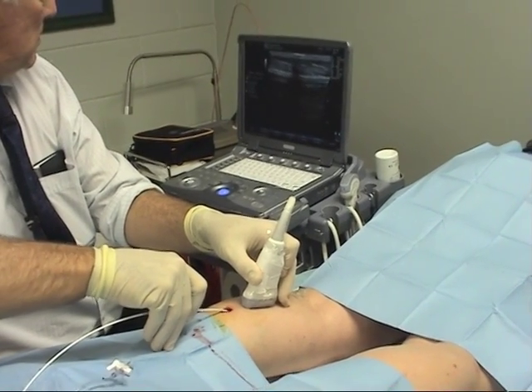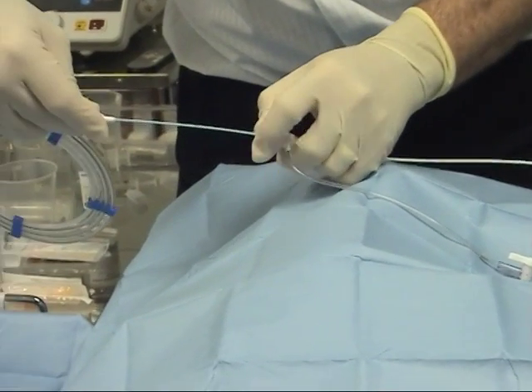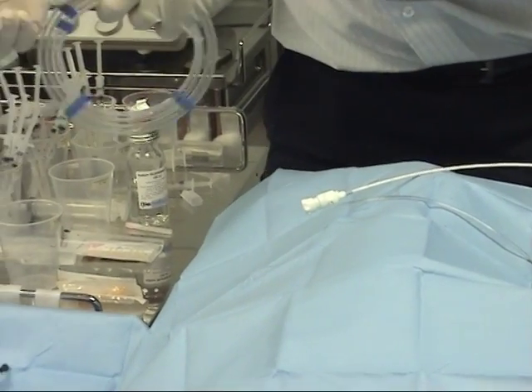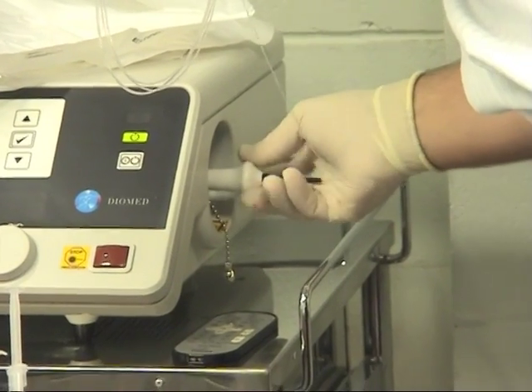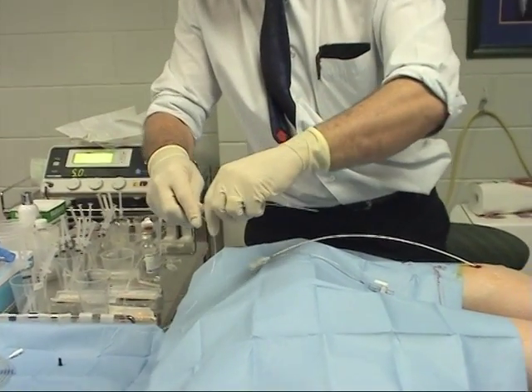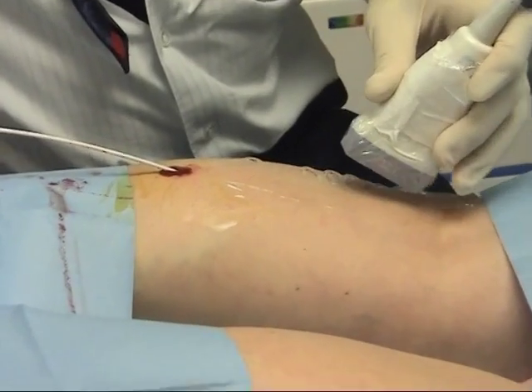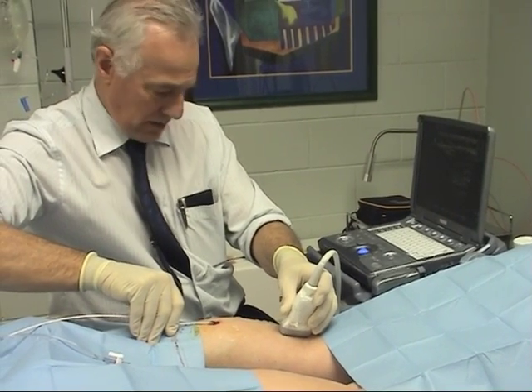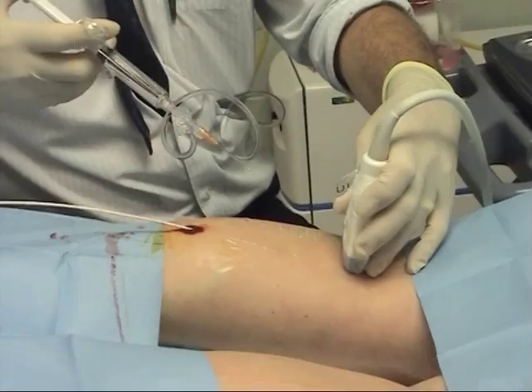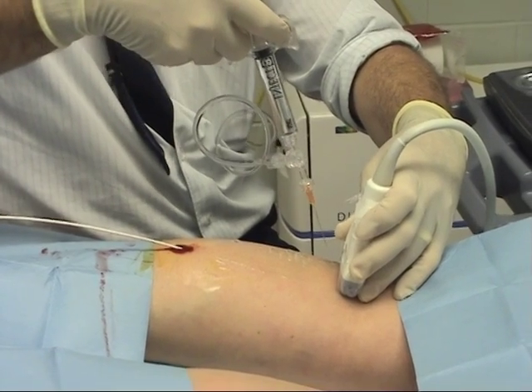Just going to track where that goes. Next is just to take out that guide wire and we'll get the laser fiber in there. Right on to the laser. I'm just going to check that it's sitting in a nice position, and then I'm going to put the local around after this. Now we're just going to use the local to numb it — it takes the longest of everything else we've done.